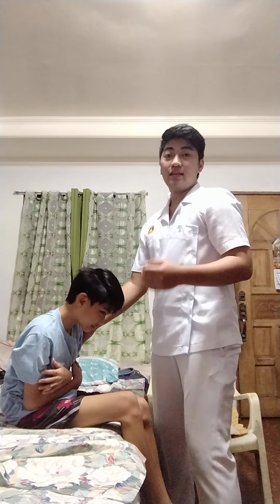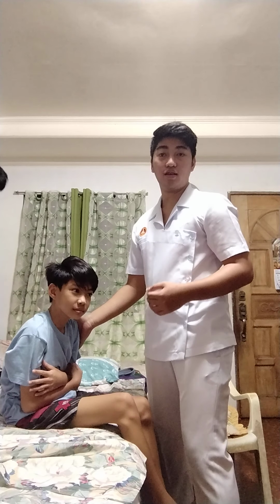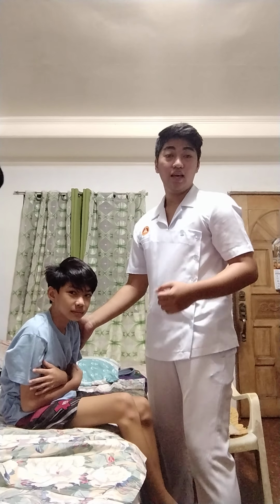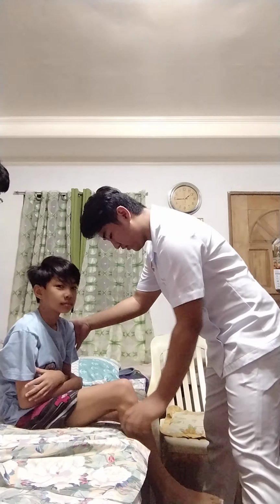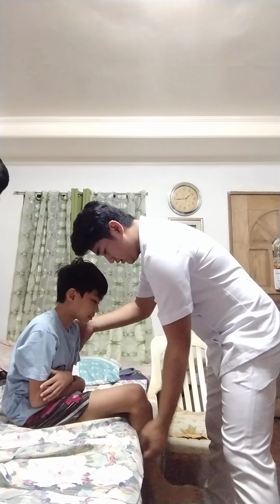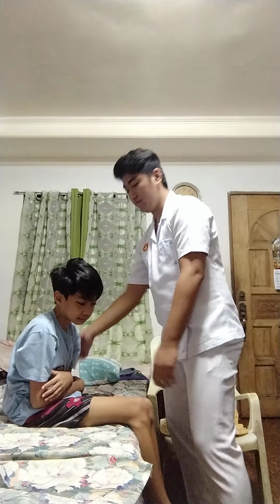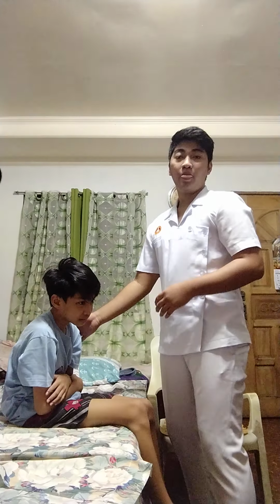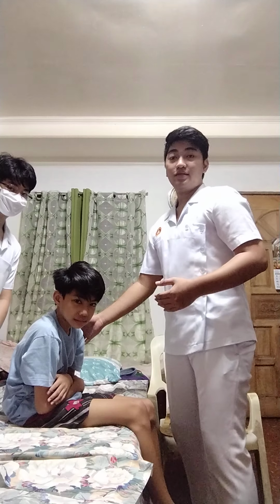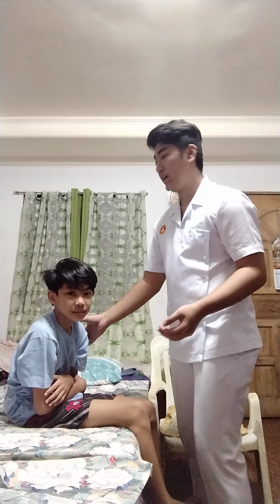So next, stand in front of the patient and assess for any balance problems or complaints of dizziness, and allow the patient's legs to dangle a few minutes before continuing. And next, assist the patient to put on a robe as necessary and non-skid footwear.